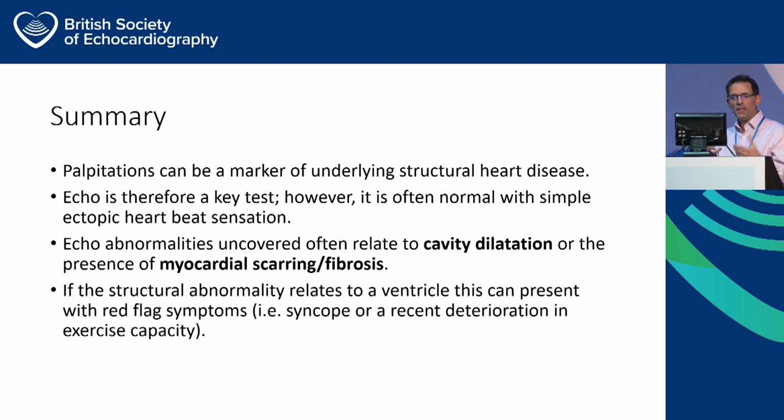Now, when you do find echo abnormalities, it often relates to cavity dilatation or the presence of myocardial scarring or fibrosis. And if that structural abnormality relates to a ventricle, that can present with red flag symptoms, which is when you really need to be pushing forward their care with great vigour to make sure they get through the system as quickly as possible. Okay, thank you very much.